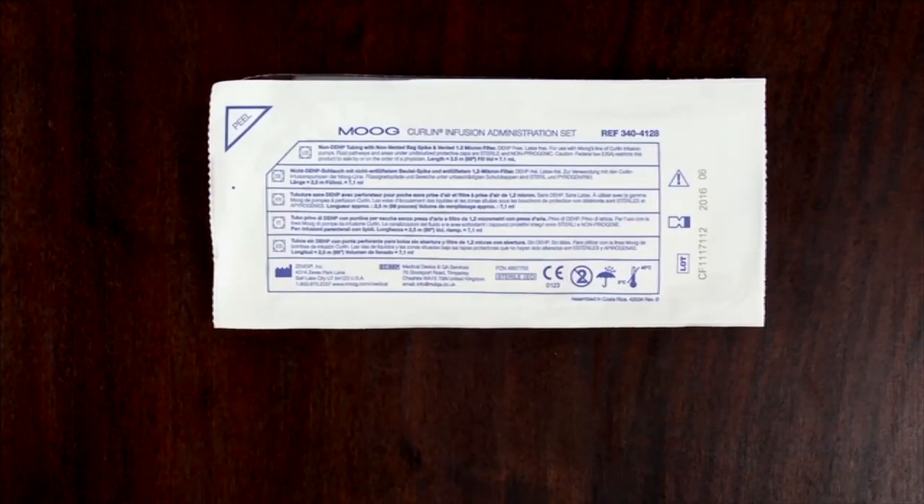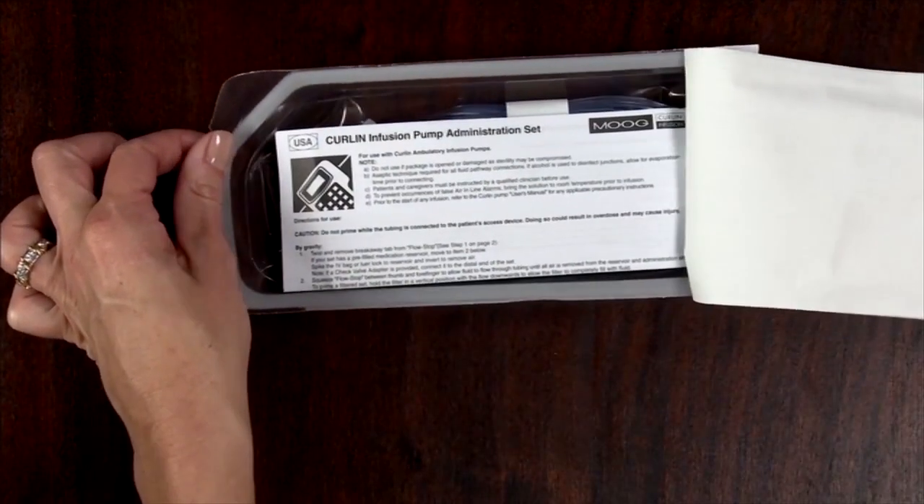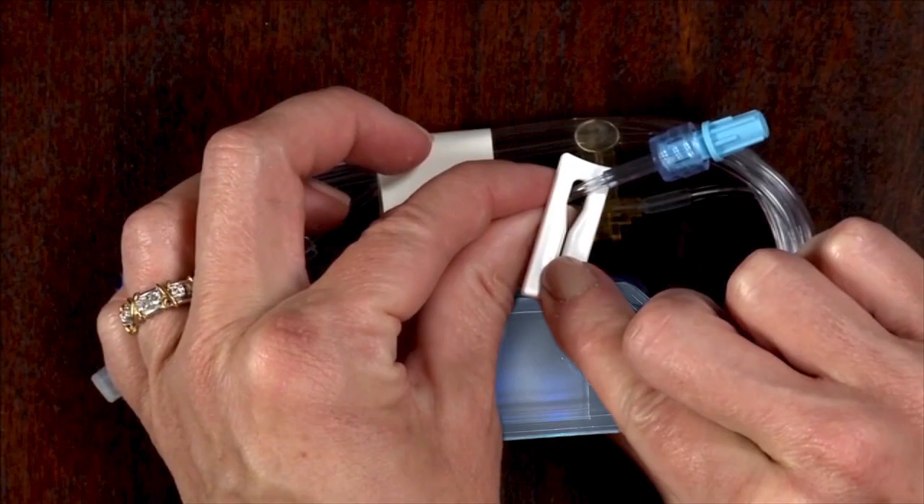For reference, find the product number, set description, and fill volume of the set on the package. The lot number and expiration date can be found at the end of the front of the package. Refer to the included directions for use for further instructions for the specific set you are using, including priming instructions for filtered sets. When removing the set from the package, always inspect the packaging and the administration set for any damages before use.